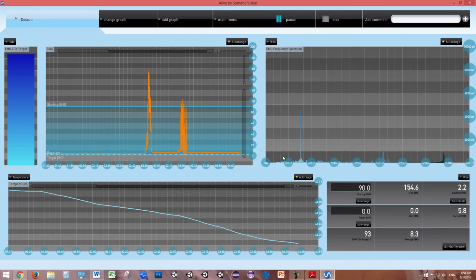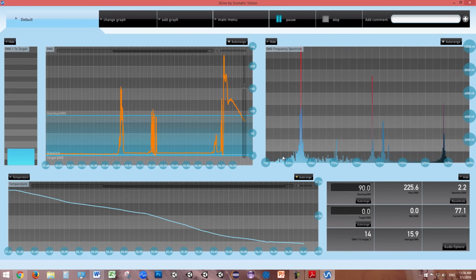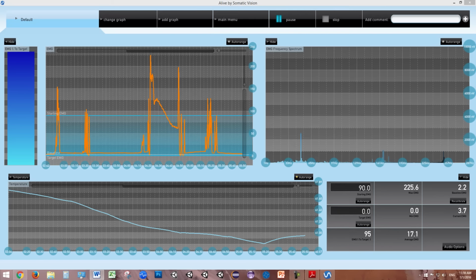If you're training muscle activation using EMG, a moderate size spike probably won't interfere with your ability to measure muscle activation. If you see very large spikes like this, you need to reduce electrical interference or improve your connection. Now let's train muscle tension with EMG activation. Again, when training to increase tension, be very careful not to strain your muscles.